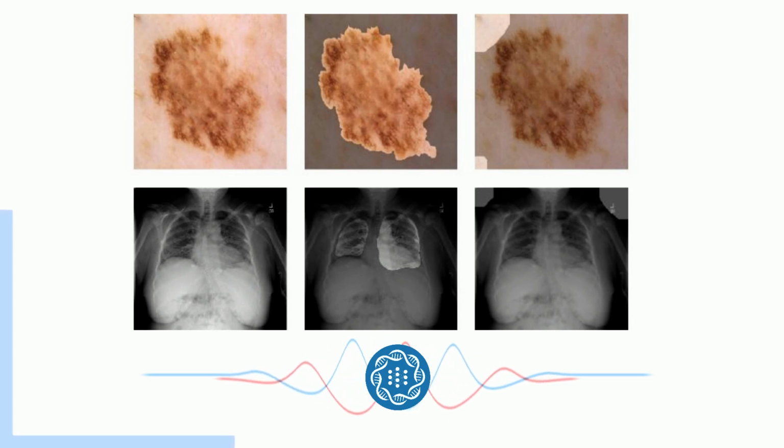Can you give us an example from the research? How did this actually play out? Sure. So in those skin lesion pictures, the original XAI would often be highlighting the healthy skin around the lesion, but SegX was able to just focus on the lesion itself. So it gave a much more clinically relevant explanation. That makes a lot of sense.